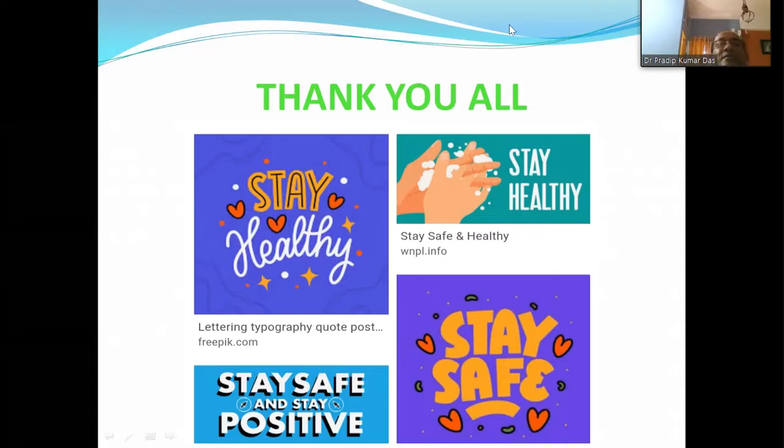ট্যাকিকার্ডিয়া আসবে। যে রেটে 100 এর উপরে আসবে, তখনই আমরা তাকে লেভেল করে দেবো দিস ইজ ট্যাকিকার্ডিয়া। তার আগ পর্যন্ত ট্যাকিকার্ডিয়া বলতে পারছি না। আর রিদমটা জাংশনাল কিনা আমরা ওই যে পি ওয়েভের মরফোলজির উপর দেখবো, আর রেটের উপরে নামটা নির্ভর করবে। ক্লিয়ার হয়ে গেল?